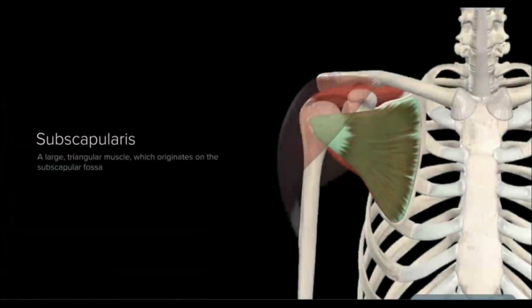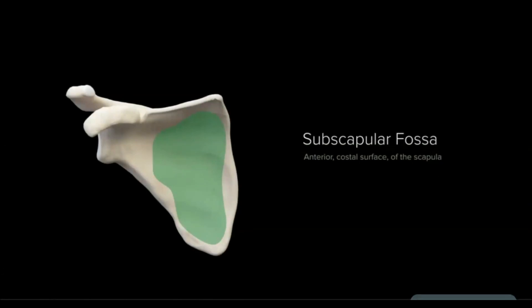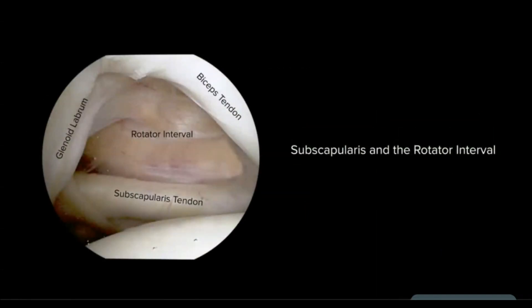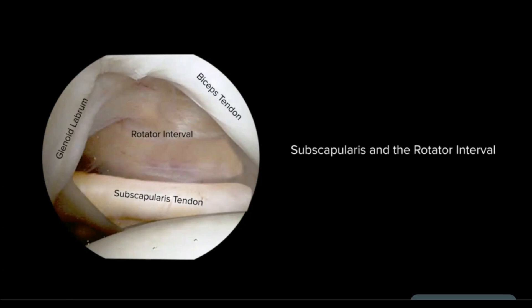As a brief overview, the subscapularis is defined as a large triangular muscle which originates on the subscapular fossa of the scapula and inserts on the lesser tuberosity of the humerus. The subscapularis is the most anterior rotator cuff muscle. Here you can see an intra-articular image of a right shoulder viewed through a standard posterior portal, where the rolled tendon of the subscapularis can be identified going right to left across the image.